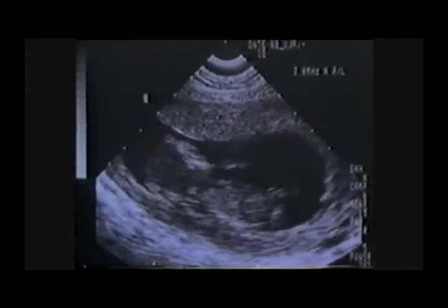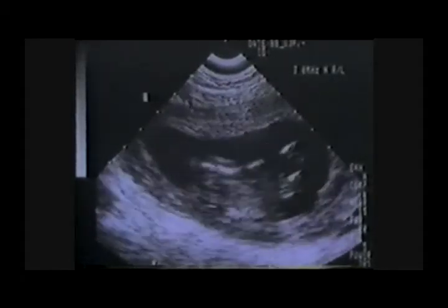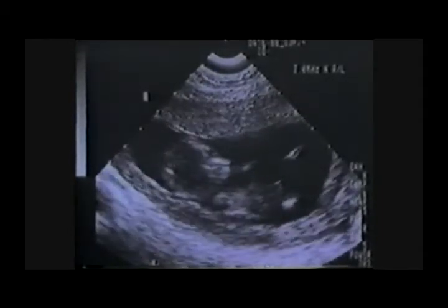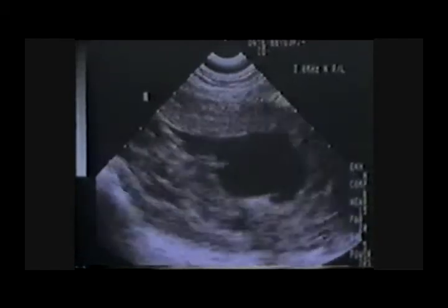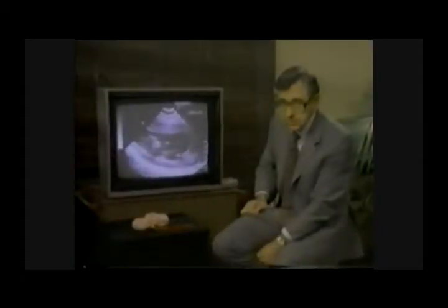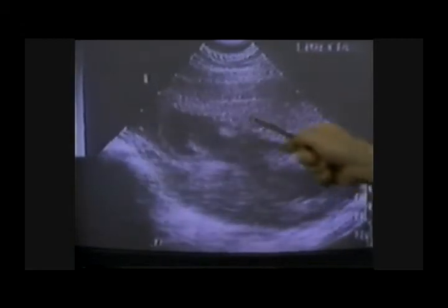It is moving away. One can see it moving to the left side of the uterus in an attempt, a pathetic attempt, to escape the inexorable instruments which the abortionist is using to extinguish its life. Now, the heart has again perceptibly speeded up. We can time this at approximately 200 beats per minute, and there is no question this child senses the most mortal danger imaginable. The membrane has now been punctured and the fluid has escaped. One no longer sees that large reservoir of fluid surrounding the child.